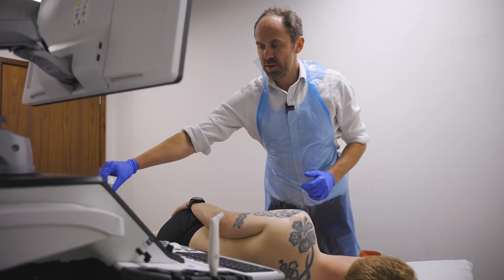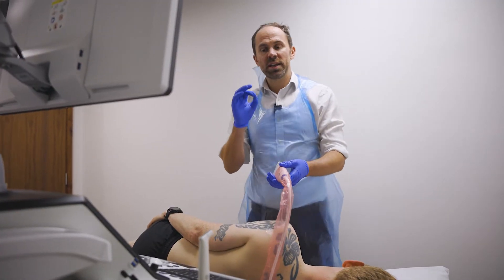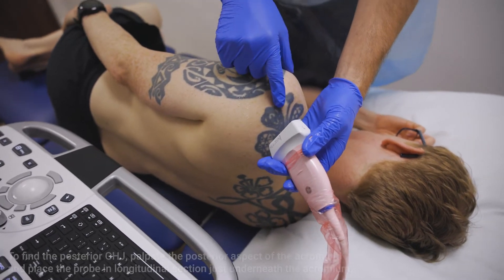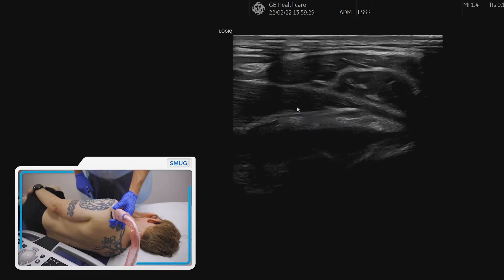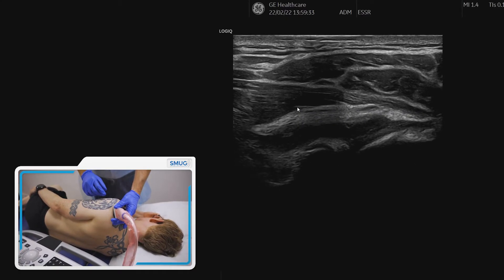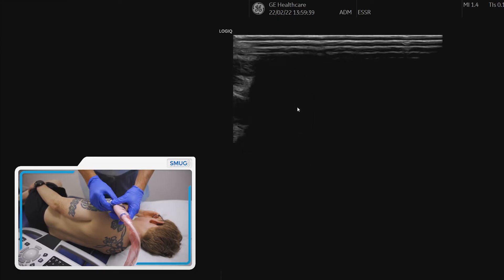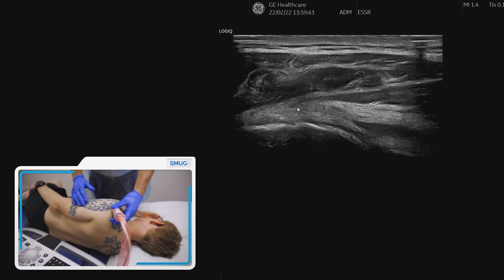The first thing to do whenever you're carrying out an ultrasound guided injection is to get a really nice clear image. A simple way of finding the right position is to find the posterior aspect of the acromion and just place the probe just underneath the acromion. It's important to know which side is which — you can see the top of this is on the right side, so I'm going to spin that round because I'd prefer that to be on the left side.